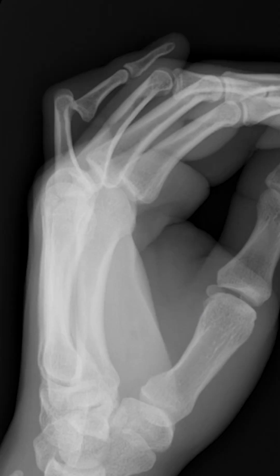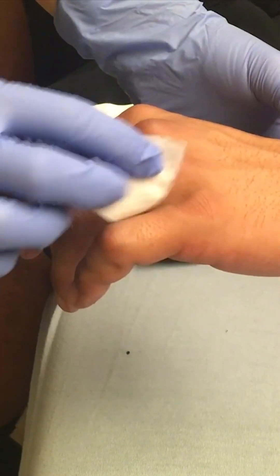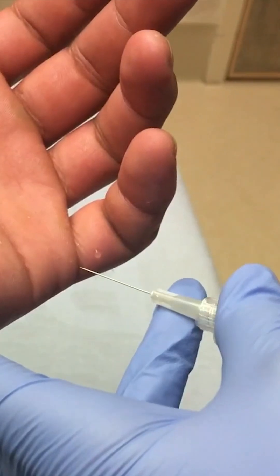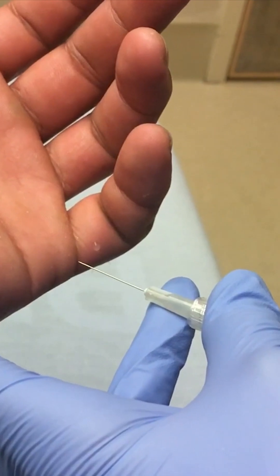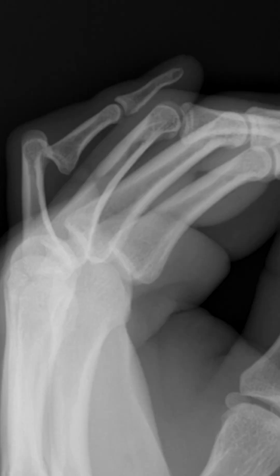This x-ray confirms a volar dislocation at the PIP joint of the fifth finger. I do offer patients a digital nerve block if they want it. Prep the skin — the needle is inserted from the palmar side to each side of the base of the finger along the course of the digital nerve.